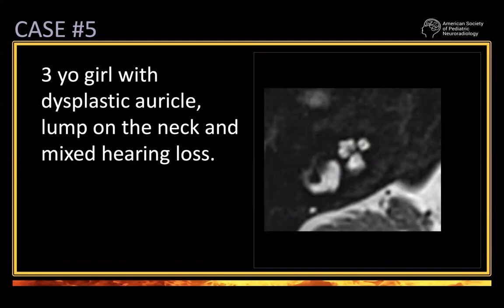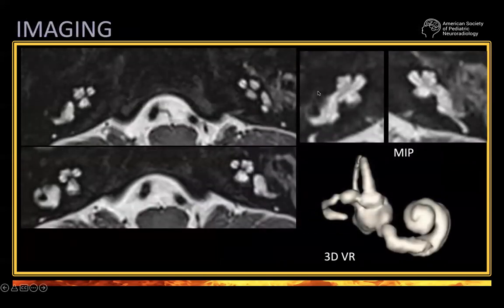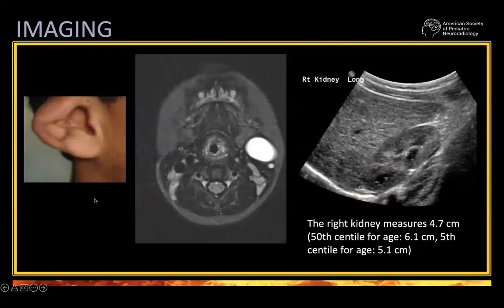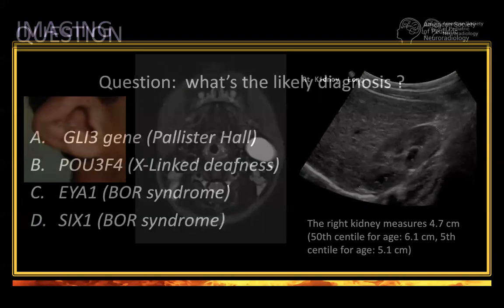Finally, case five: a three-year-old girl with a dysplastic auricle — a strange ear, like in CHARGE — a lump on the neck, and mixed hearing loss. Look at this cochlea: there is the modiolus, the interscalar septum, the spiral lamina. Is something wrong in the apex? There's like an extra spike on the apex. On 3D it shows a bit of abnormality in the apex. The kidney is smaller for age. So you have this association: ear, neck, kidney, and cochlear abnormalities.